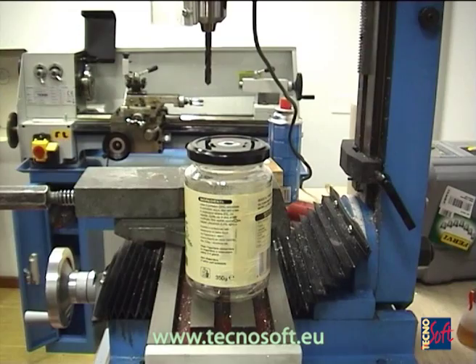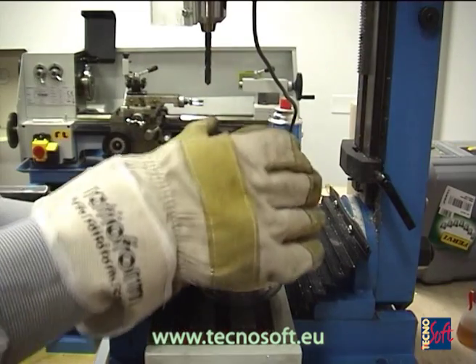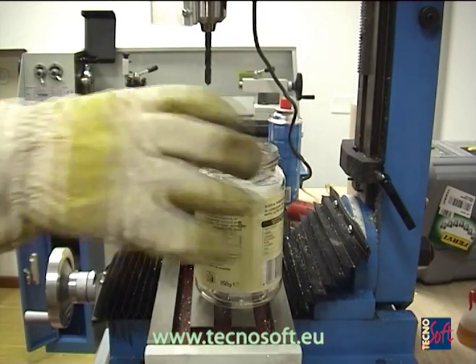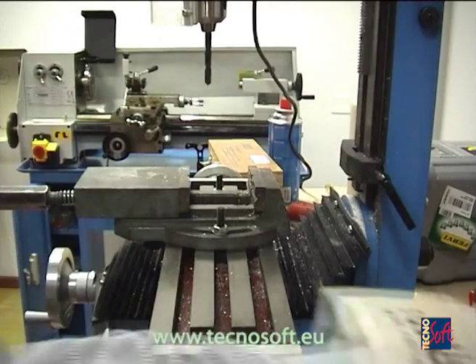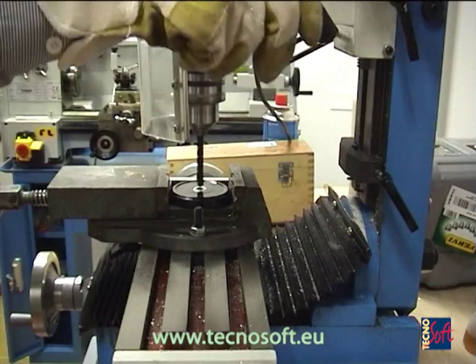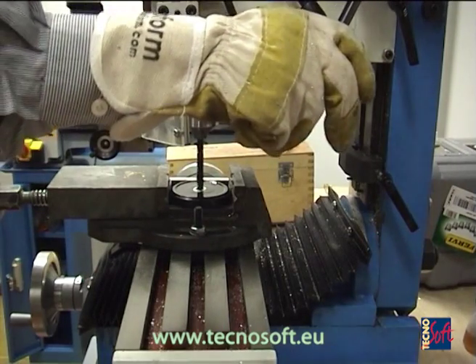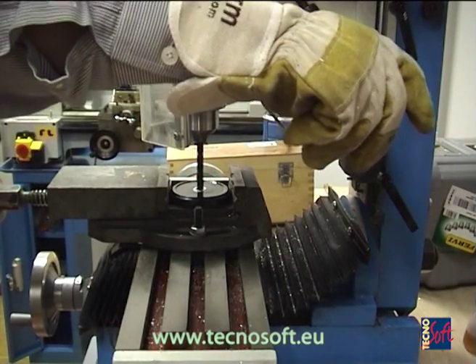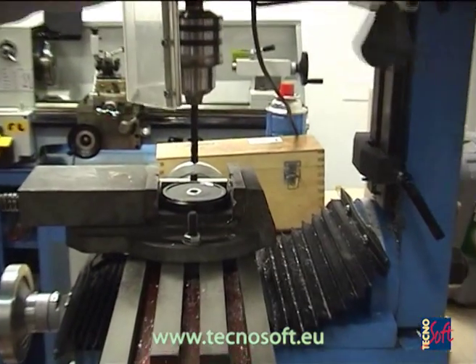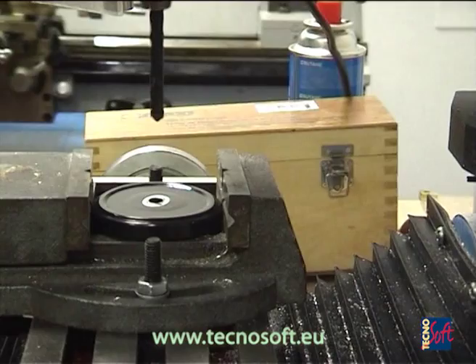To leave the data logger outside and insert only the probe in the container, we need to prepare it. We'll keep using a jar as an example, drilling a hole in the cap. Remove the cap, place it under a drill, and drill the hole. It must be at the center to reach the core of the product.